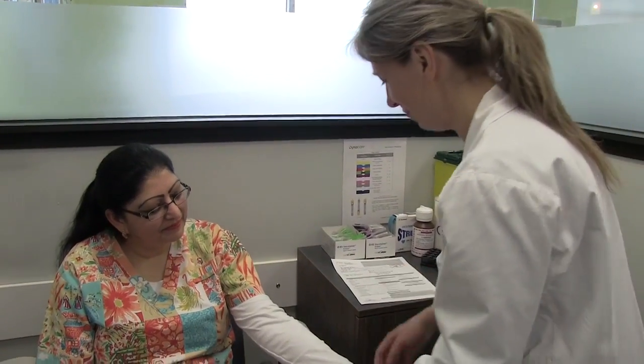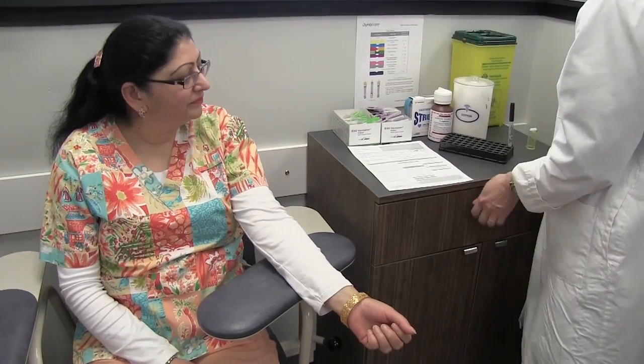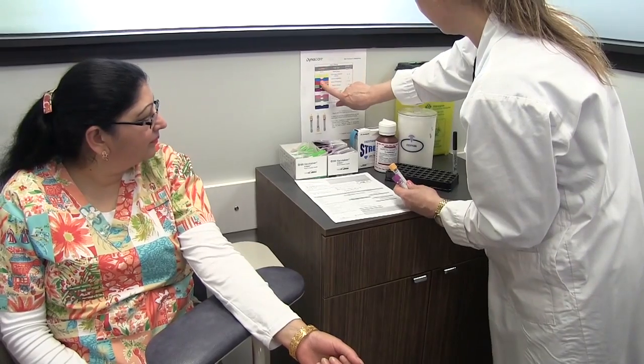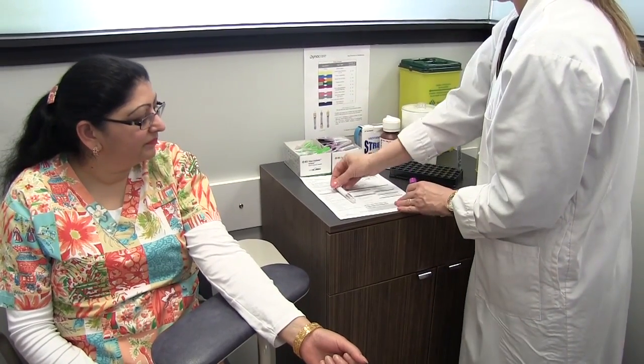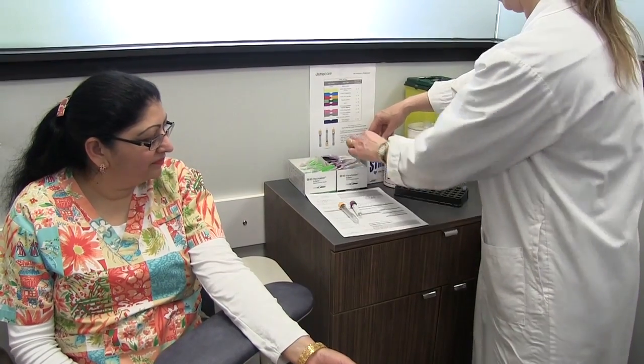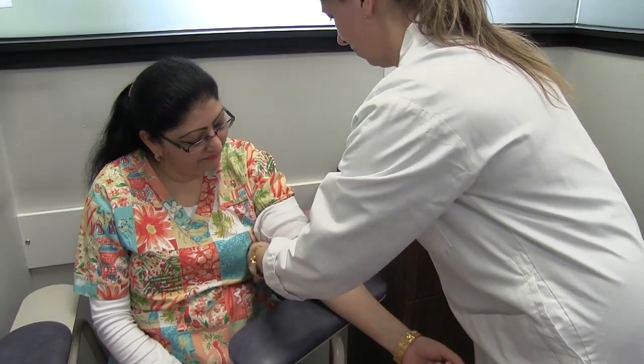Ask your patient if they have a preferred arm and check with them to confirm they are seated comfortably in the phlebotomy chair. Start gathering your supplies. Follow the order of draw checklist and place your tubes in that order for the collection. The order is important to avoid cross-contamination of additives and to promote accuracy of test results.